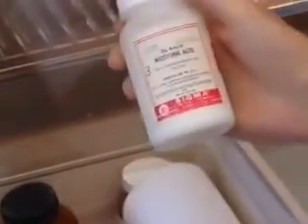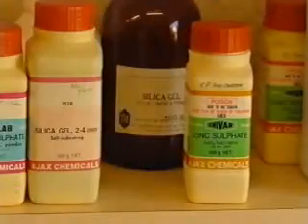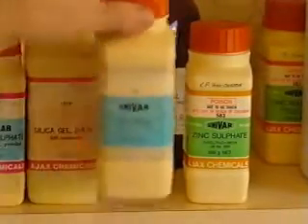A culture medium consists of all the mineral and organic nutrients that the plant requires for sustained growth. These are all the macro and micro elements, the vitamins and other growth factors such as myoinositol, glycine, nicotinic acid, pyridoxine, thiamine, etc.